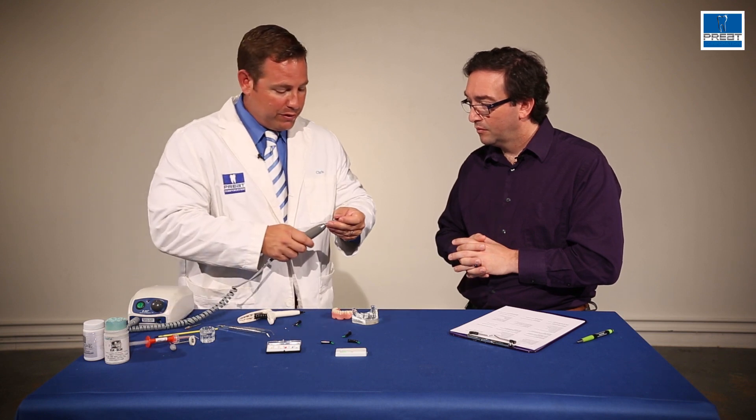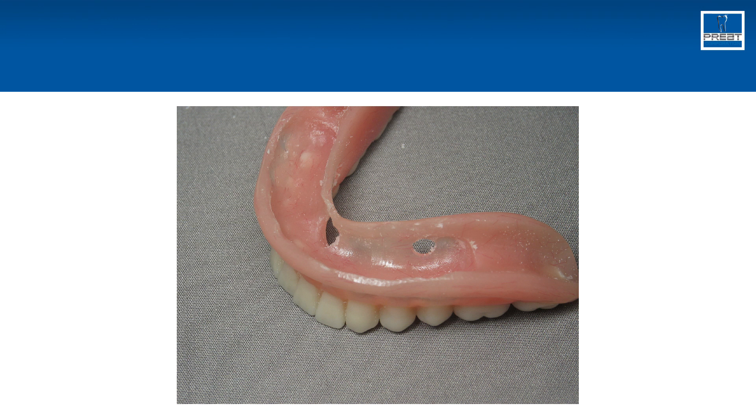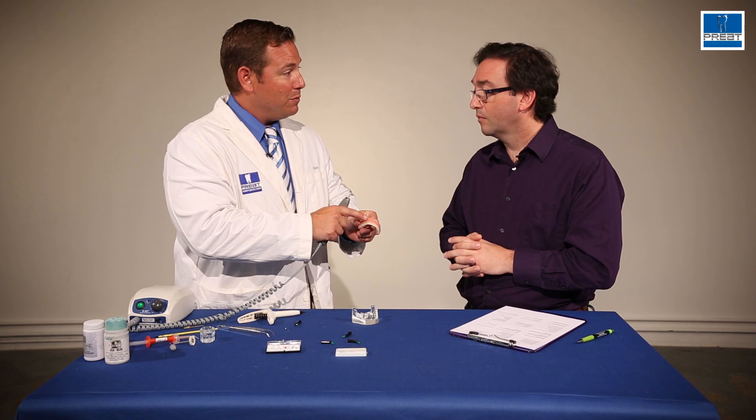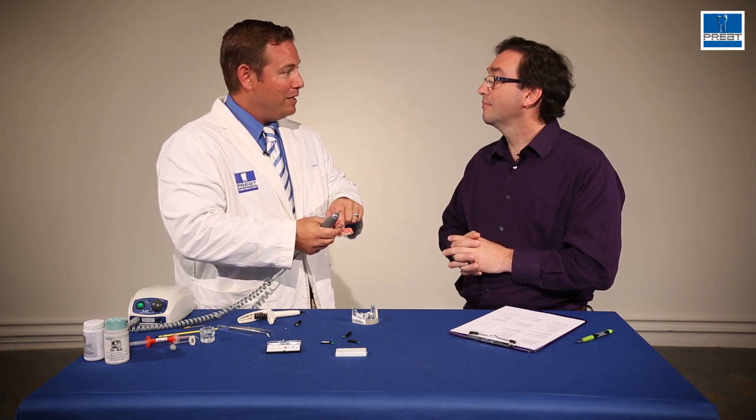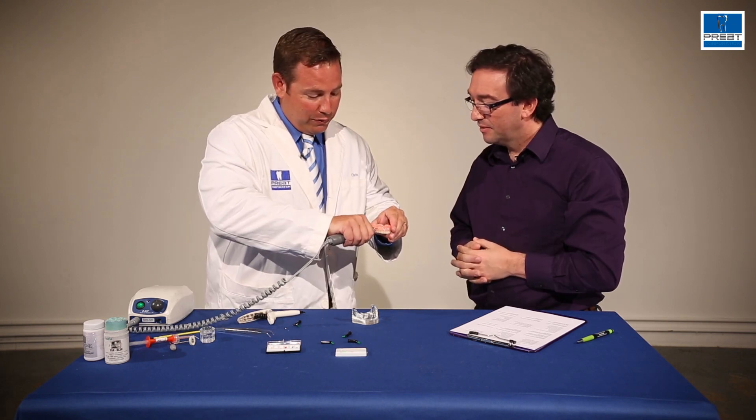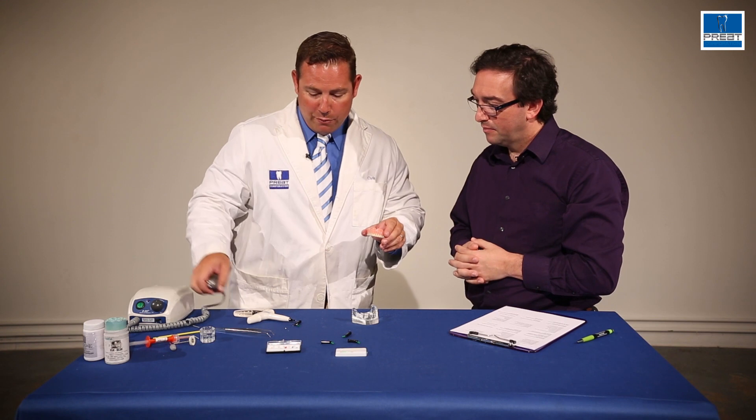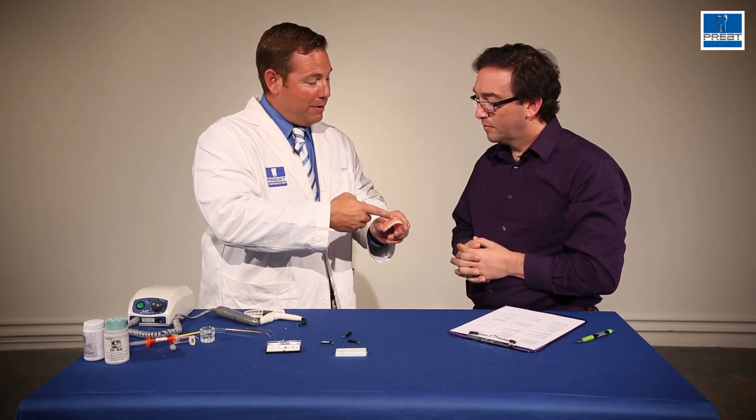Since we're going to be using self-curing resin, I want to drill an escape vent. Depending upon the patient's smile line, if the patient shows a lot of the pink of the denture when they smile, I'm going to come from the lingual. If the patient doesn't show a lot of pink, I'm going to come from the buccal surface. Why is that? The patient will play with that little hole in the lingual, even when it's backfilled. So I'm just going to cut a little tiny escape vent through here into where I'm going to be picking up the acrylic. So that way, if we put too much acrylic in here, instead of flowing down and wanting to lock underneath the bar, it'll come out through this little hole.